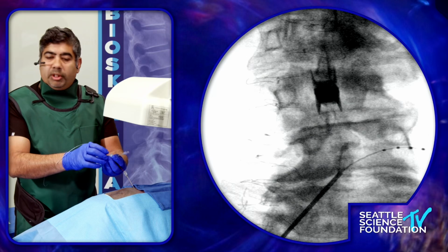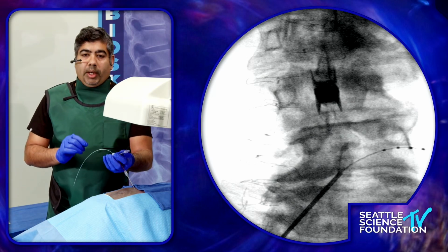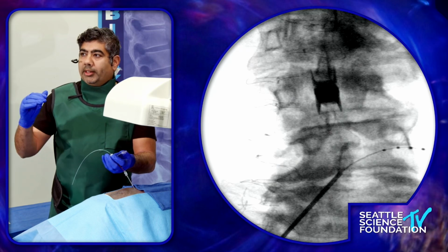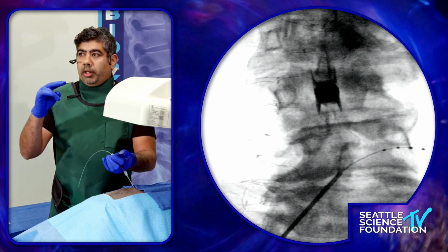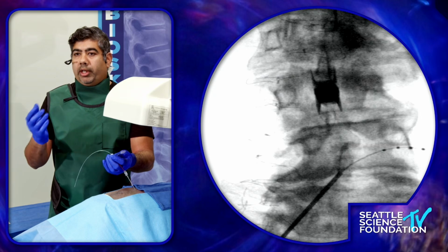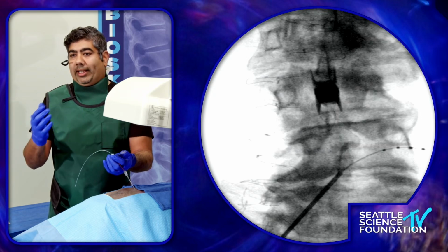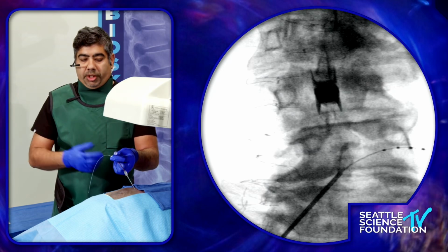And so what I'm going to do is basically the first position is the two middle contacts on that lead. They are basically right below the inferior pole of the pedicle. And the reason is because the middle two electrodes rest on top of the DRG. So your rep can essentially bounce electricity off the first or the fourth or the second or the third and can modulate that DRG, which is your target DRG.